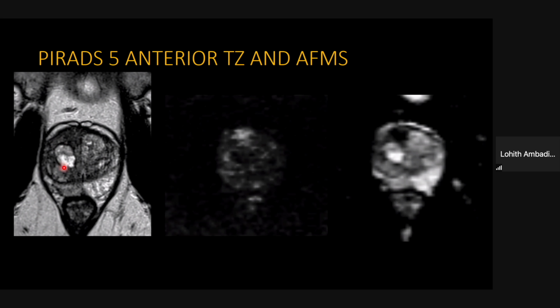This is a typical prostate BPH nodule with a capsule. Now, anterior to that, you can see a lesion in the transition zone. And this dark band is the anterior fibromuscular stroma. Anterior fibromuscular stroma looks dark on all sequences. Now, this is slightly grayish as compared to the dark anterior fibromuscular stroma. And now you can see that this area is normal, whereas this AFS on the right side is thinned out because this lesion is involving the transition zone and a part of the anterior fibromuscular stroma.